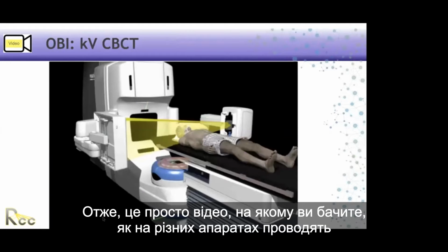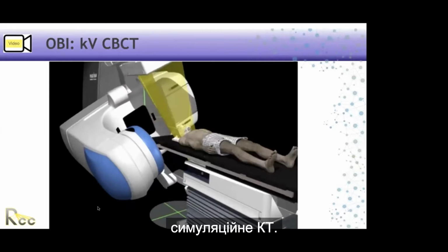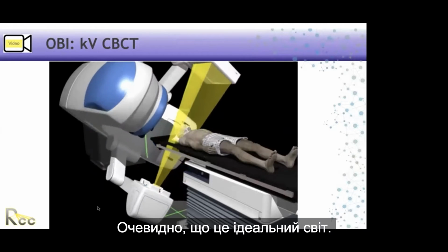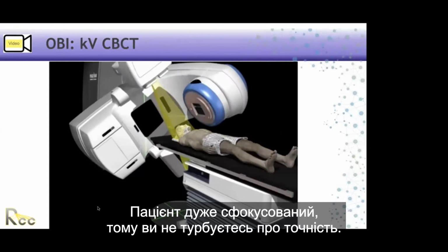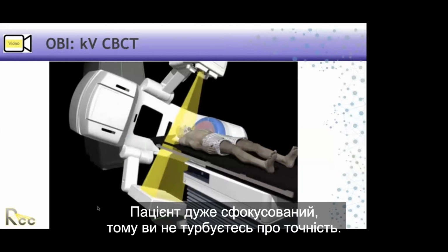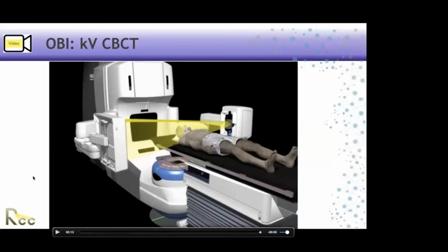This is just a video showing you on a Varian machine acquiring a cone beam CT. This is obviously the ideal world. The patient is very centered, so you're not worried about clearance. And this is a full 360-degree rotation.